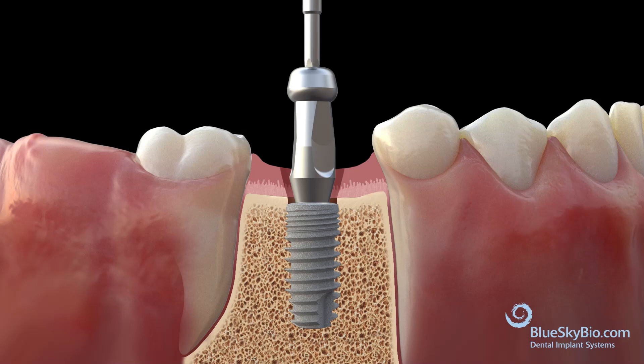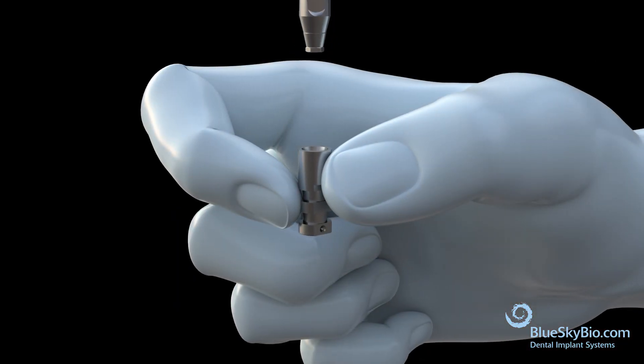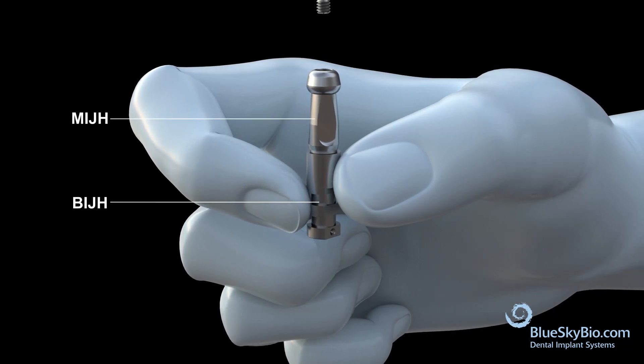Remove the impression coping and attach to the analog. Form a combo part by securing the impression transfer and analog.